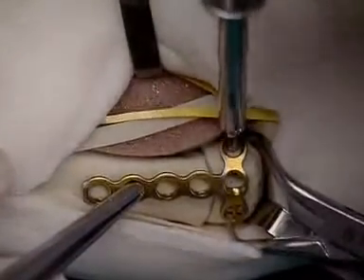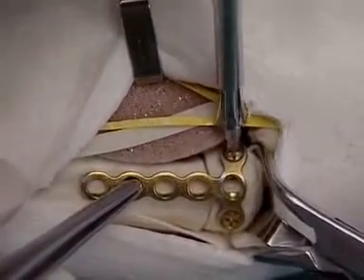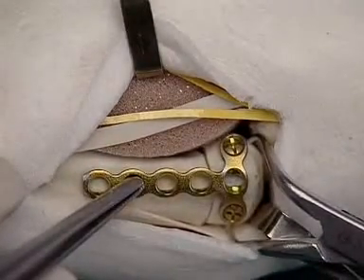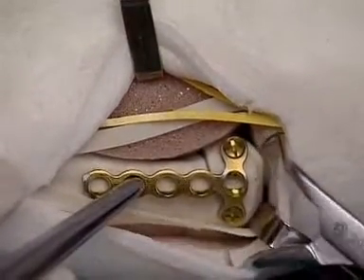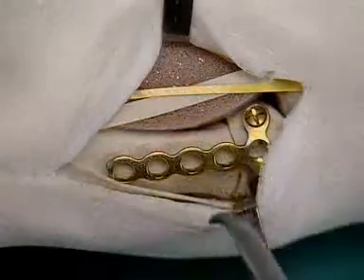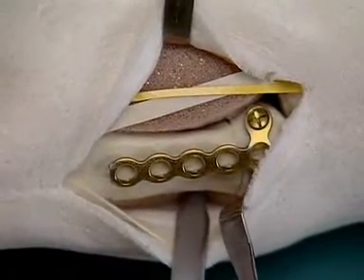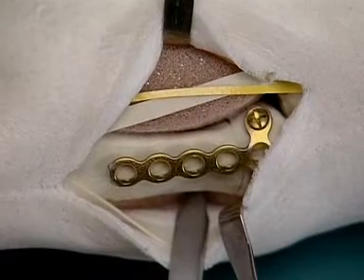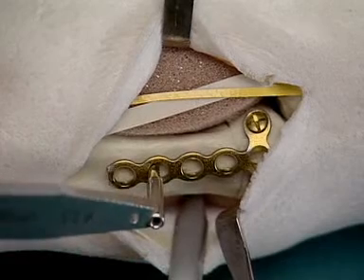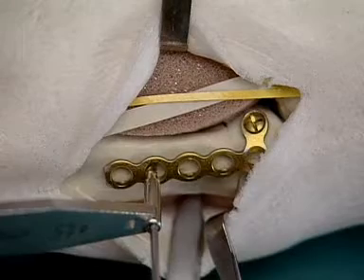In this way, when the screw is inserted, compression of the intra-articular fracture is obtained. The reduction forceps can now be removed. The thenar musculature can be retracted; at the same time, the metacarpal shaft can be reduced to the joint fragments. The 1.5 millimeter thread hole is drilled eccentrically in the middle of the three planned screw positions in the shaft to obtain compression between the shaft and the joint fragments.